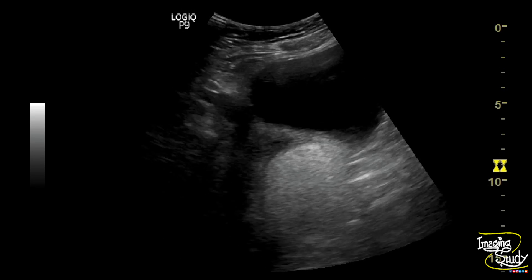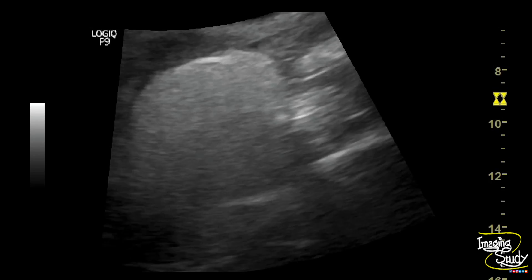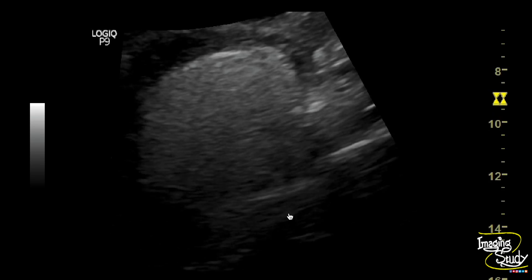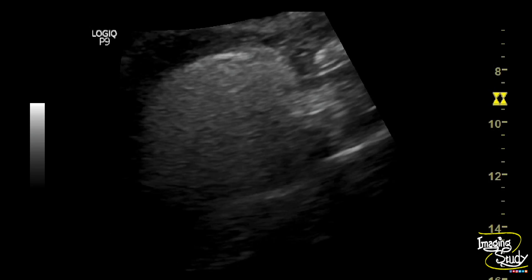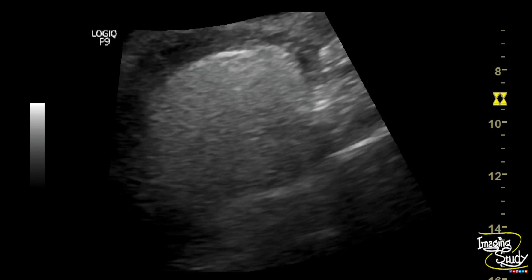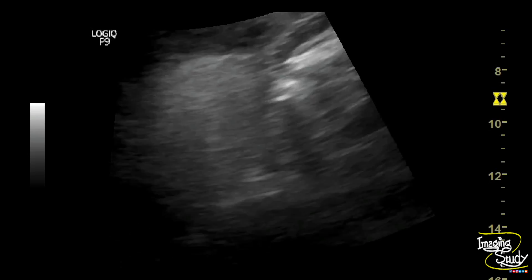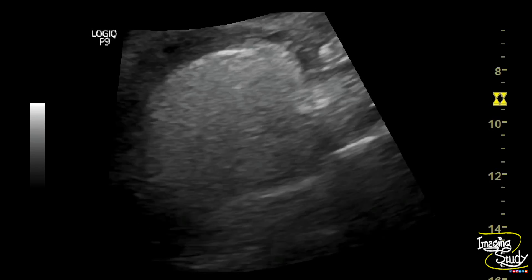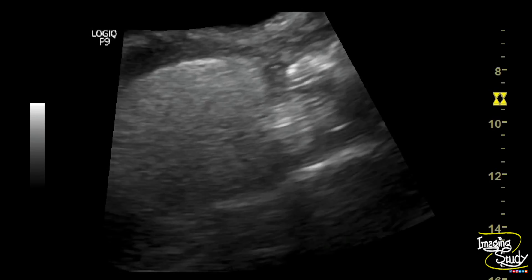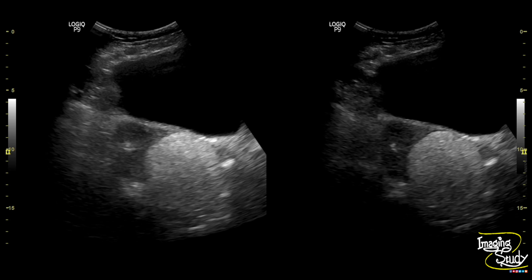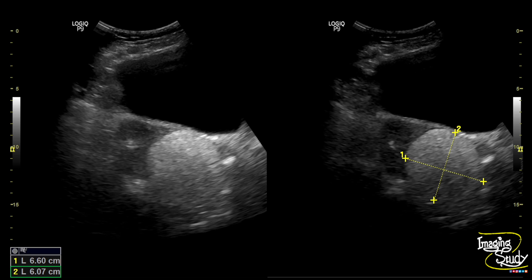If it was an endometrioma, then there should not be any sound attenuation like this. So this is the case of dermoid cyst. Here you can see the sound-attenuating hyperechoic round well-defined mass. It measures about 66 by 60 millimeters.